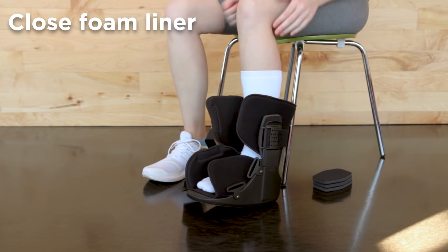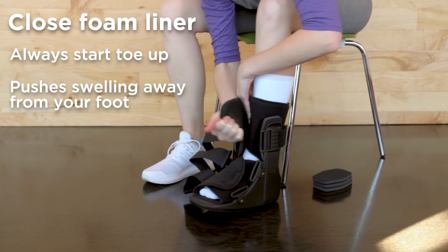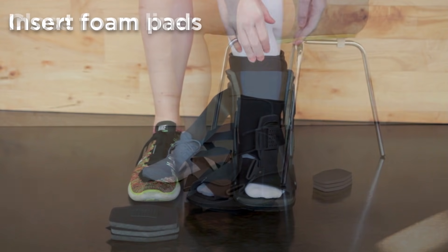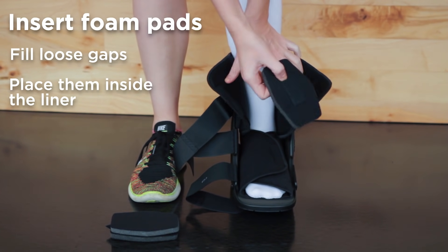Then close the liner, always remembering to work toe up. You want to work toe up because that pushes any swelling away from your foot. For a snug fit, you can fill in the gaps by placing the foam pads between the liner and the boot.